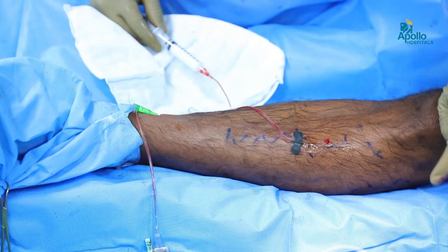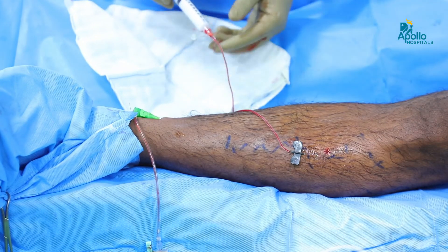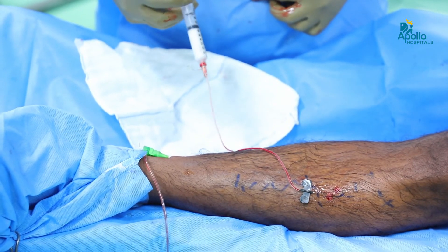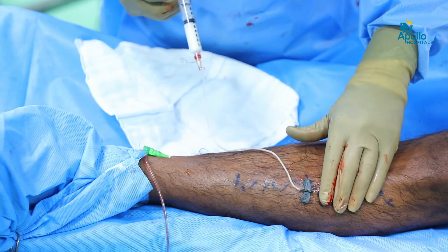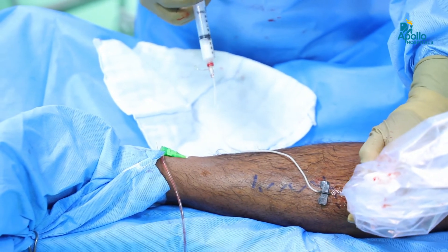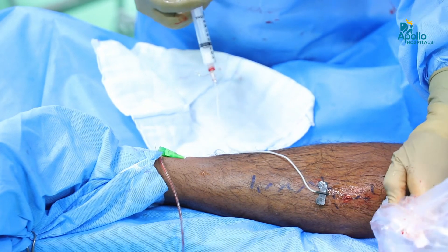For the lateral perforators, we do sclerotherapy. A small butterfly needle is inserted into the vein and sclerosant is given all along the vein, so that we can confirm on the ultrasound also that it gets obliterated.